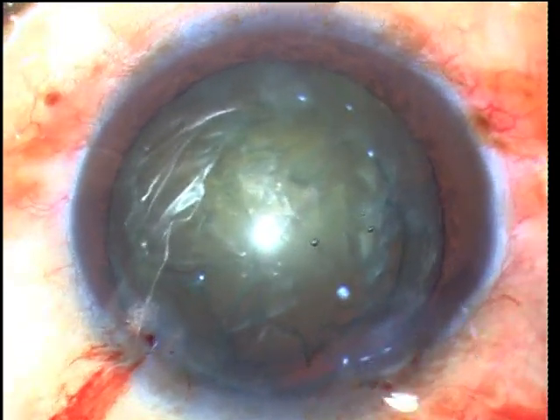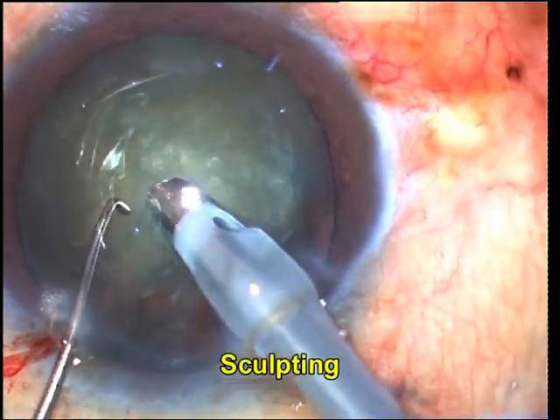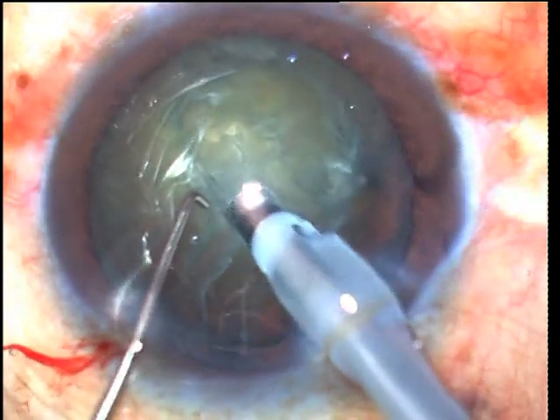The first groove is made starting above the center point of the nucleus, taking care not to engage the rim of the rhexis. The initial superficial sculpting is stopped short of the rhexis rim so as not to damage it.